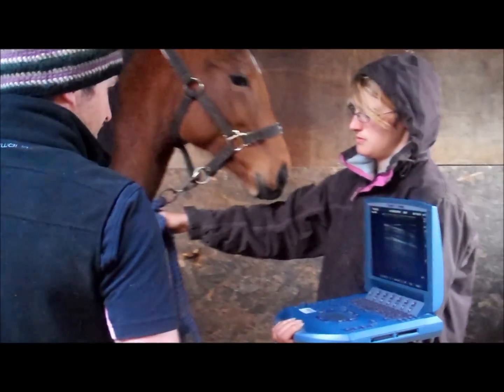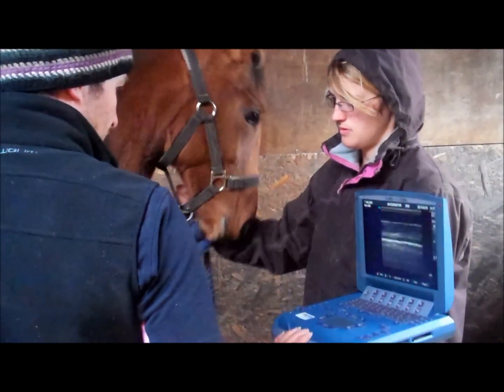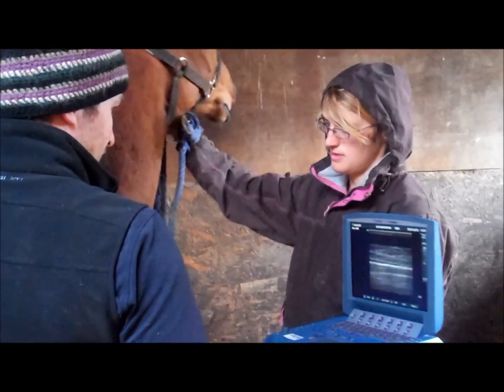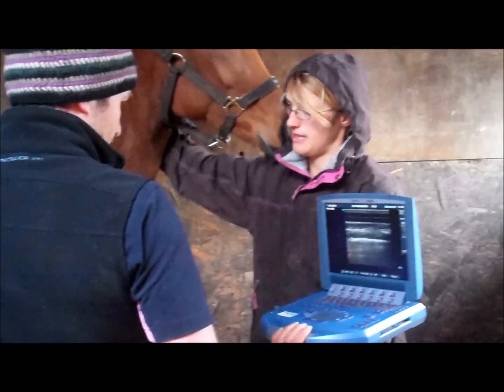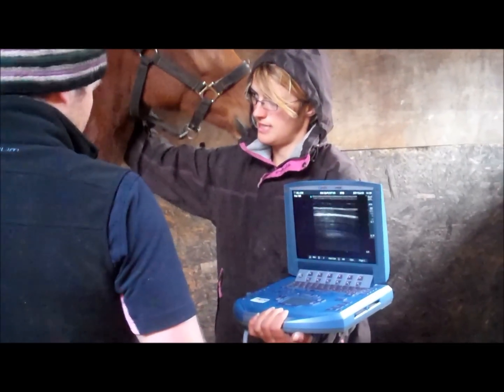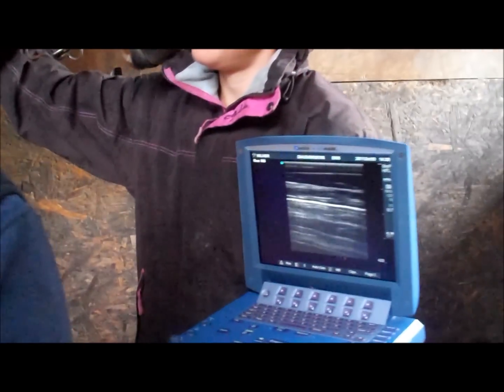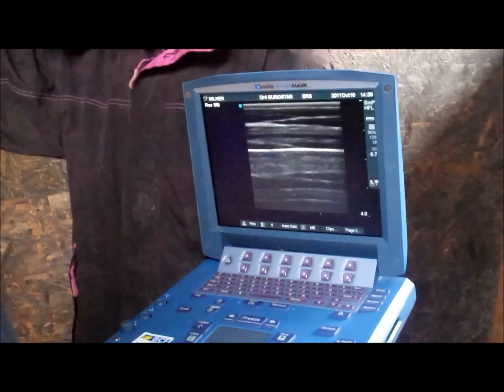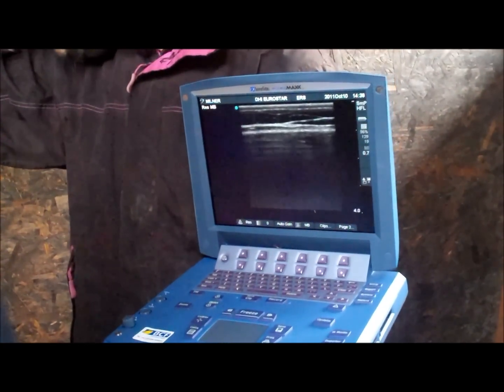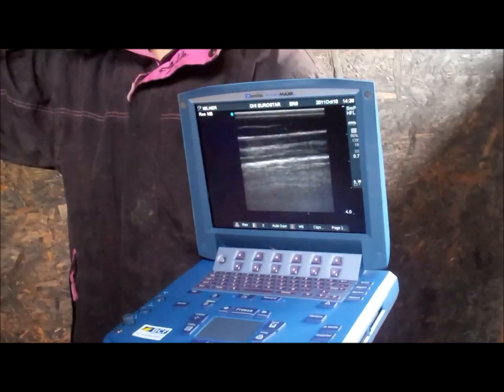Just on the basic settings, acquiring a very nice image of the chest wall and the lung surface quite simply and quickly. No sign of lung abscessation or pleural pneumonia. Everything looks quite healthy in this area of chest that we're scanning, dorsal to ventral.